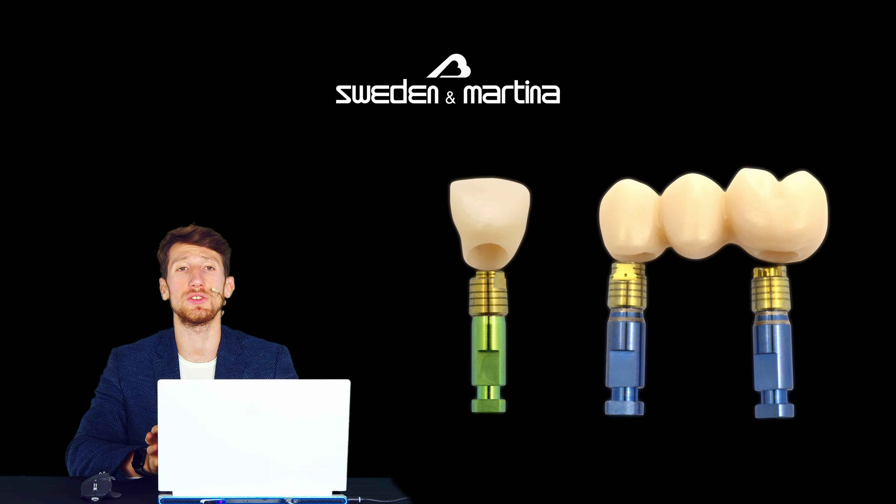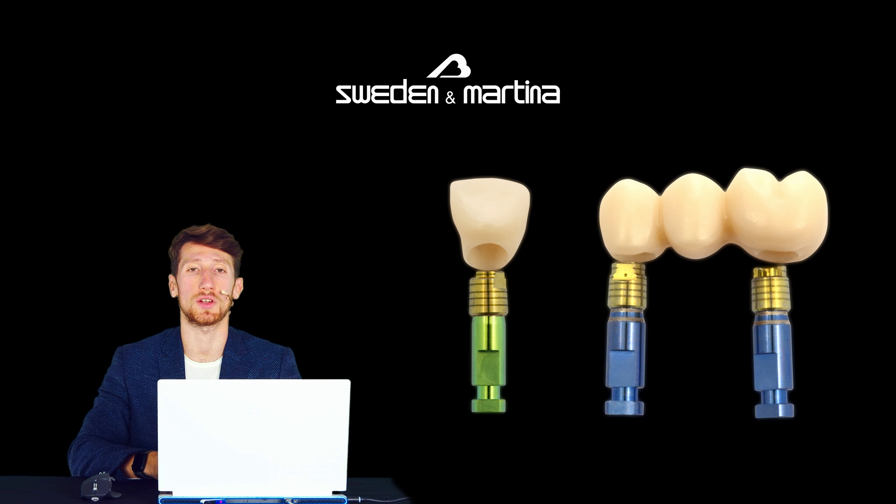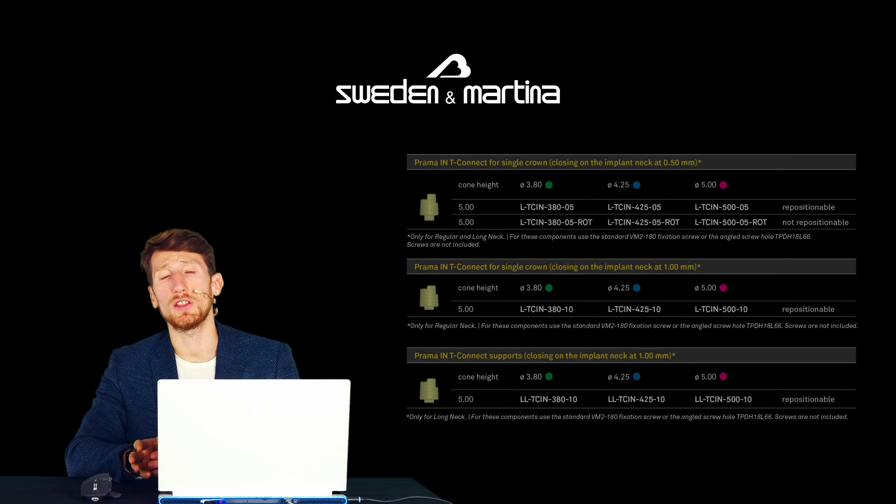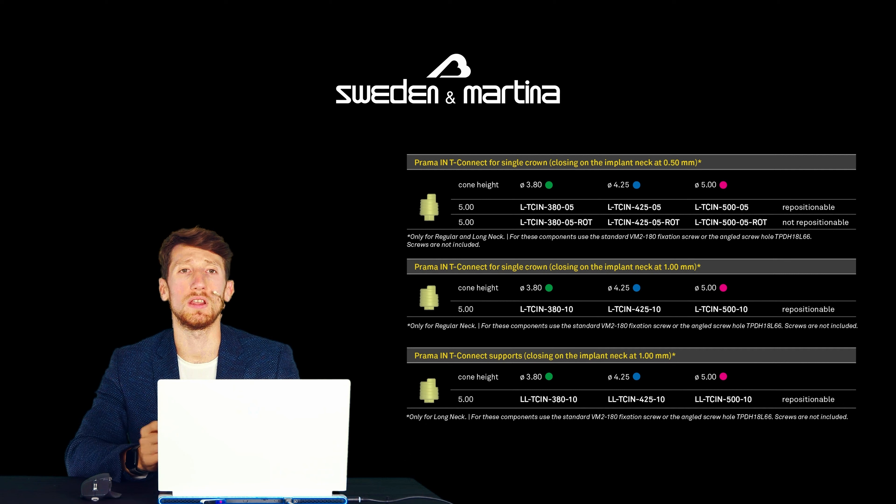Hello everyone, today we present the components available to support a crown or a bridge that closes on the neck of the Prama implant. This solution for luting technique can be used only on Prama regular neck and long neck, and in all diameters. This version of T-Bases has a 5 mm high cementation cone, both in the engaging version for single crowns and in the not engaging version for bridges and multiple structures.